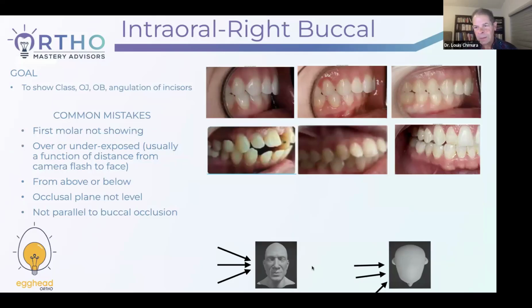Okay? Like on the lower right of those 6 photos, that's Elijah's other side. Same problem, can't see the class. Now, if you look at the upper 3 photos, that's again the same patient at 3 different time frames. Notice how each time it's different on how many teeth are exposed. Okay, that's pure and simple technique.